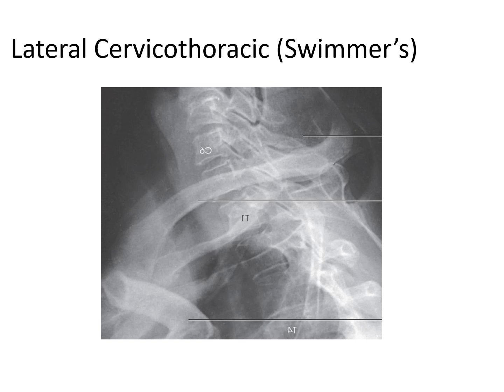Okay, so I've got some indicators there. The topmost indicator looks like a spinous process. I would say that's coming off cervical vertebrae number 5. The middle indicator is the elevated side. Oh, the top indicator is actually the center of the humeral head for the elevated side arm. The middle indicator is the clavicle for the elevated side. Okay, and then the lower indicator is actually the clavicle for the away side. So if they got the left side against the board, the lowest indicator here is the clavicle of the right side if the left side's against the board.